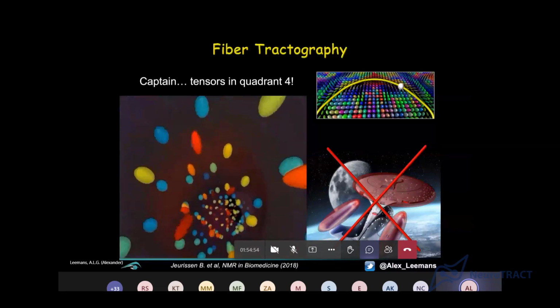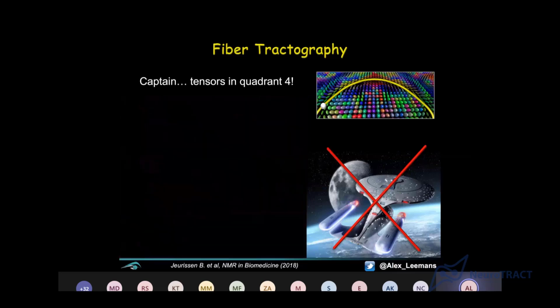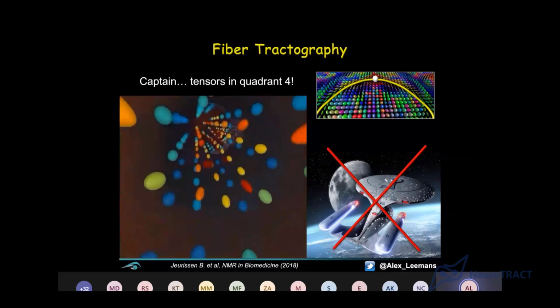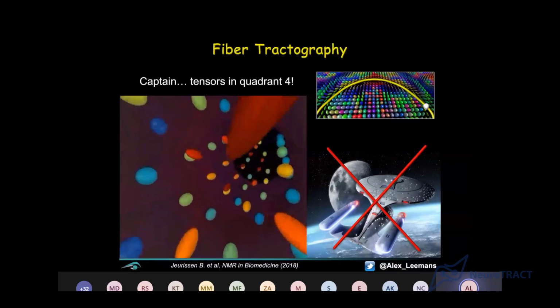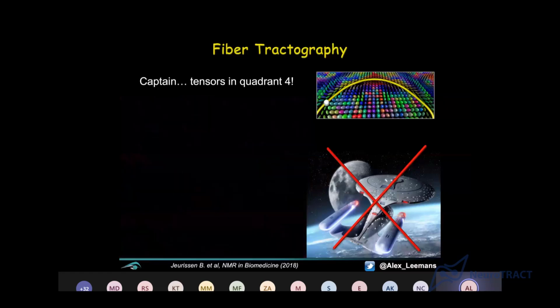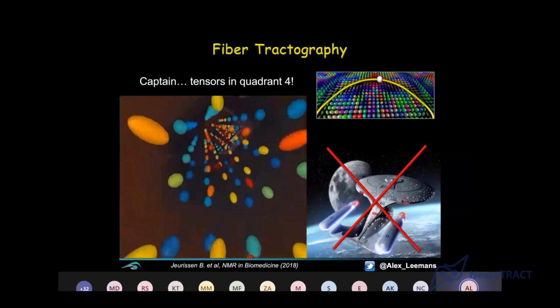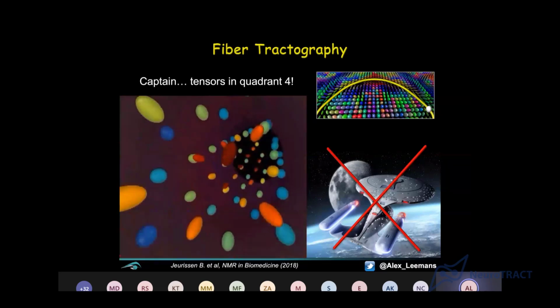So a starting point in the data is basically moving and finding areas and then following the dominant orientation of these ellipsoids. And then you get something like this animation that I made 20 plus years ago. So it's a bit old-fashioned, but it just makes the point again, right? So we're following the dominant orientation and we're moving across the data.